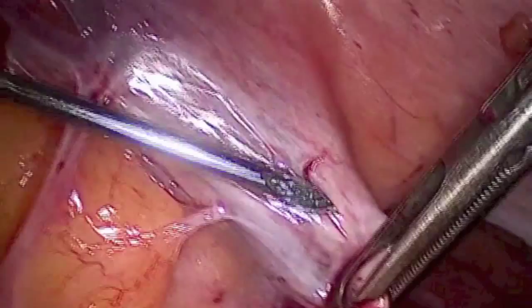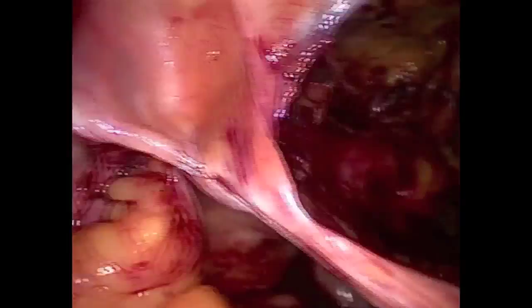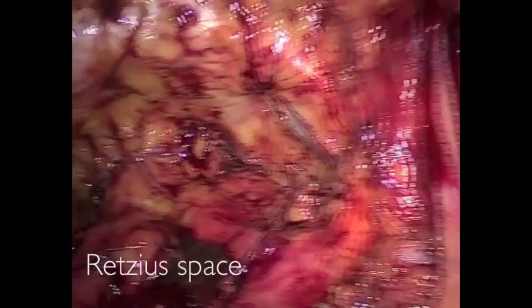Proper visualization of anatomical landmarks is crucial for the success of paravaginal repair. The peritoneum can be retracted laterally and posteriorly, improving the exposure of the Retzius space. The defect can be more easily evaluated and corrected.